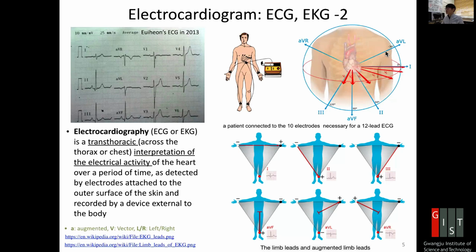And also this position from the heart location makes it roughly about 30 degrees. So you can see these are like the entity is there, and these are the projection for easy interpretation of physicians.